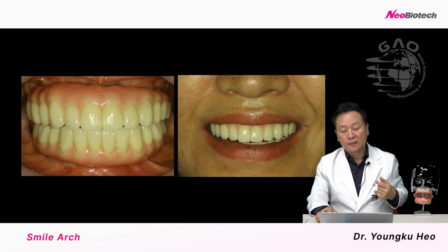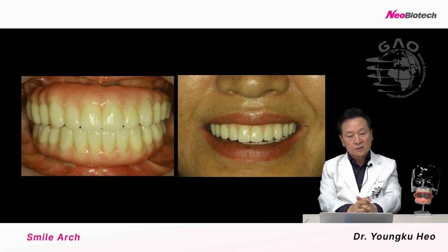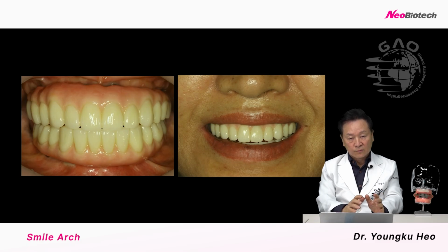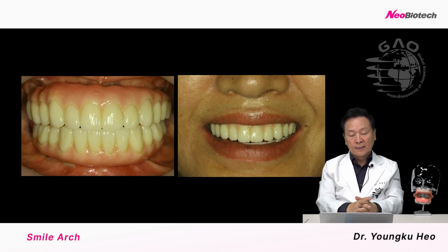So we try to make the full arch cases in each way. Especially we want to save time. We shorten the time, to give not only the provisional but also the final restoration in a very, very accurate way as soon as possible. All right.